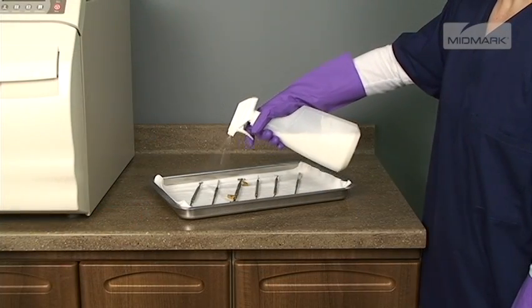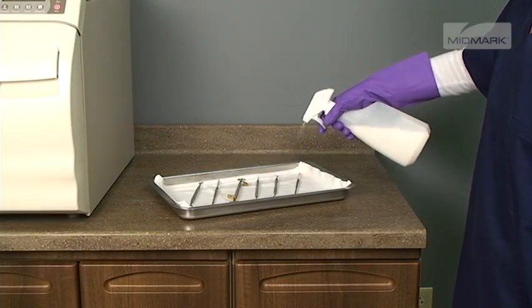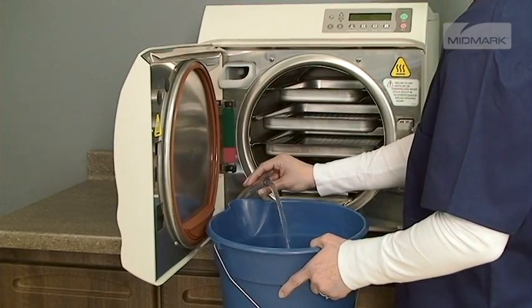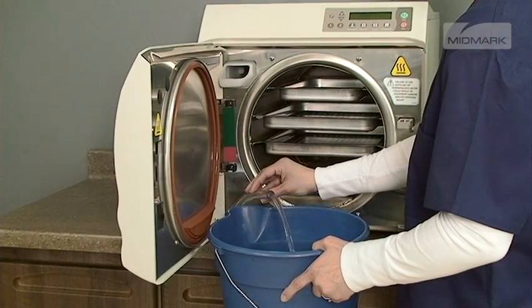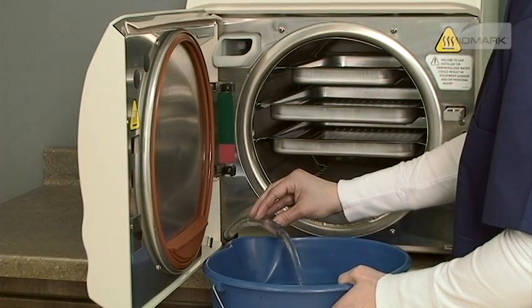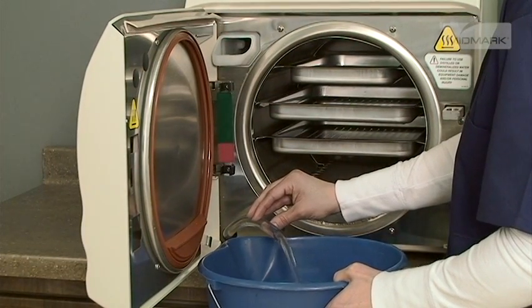If the autoclave processes instruments that have been lubricated or dipped in dental milk, the autoclave must be drained and refilled with distilled water every day. This prevents other items from being contaminated with the residue from these fluids, and also prevents excessive residue buildup from damaging the unit seals.